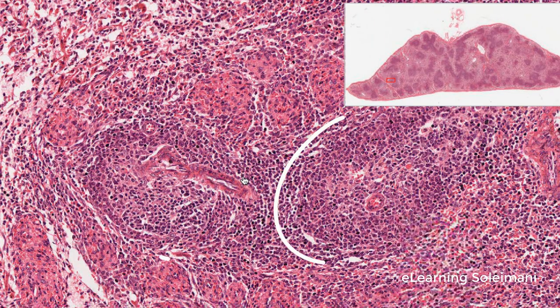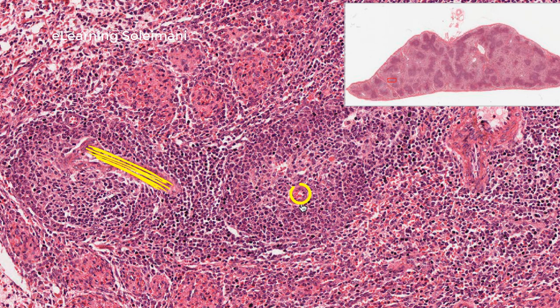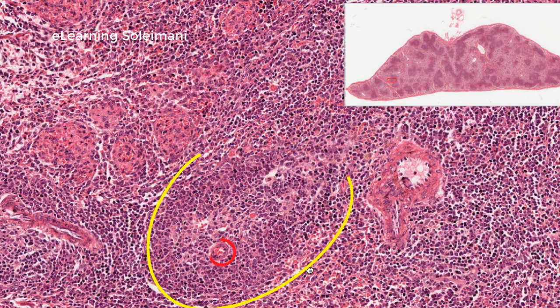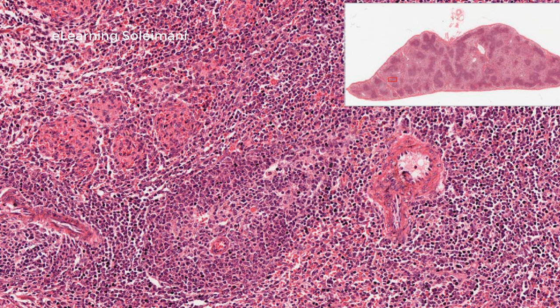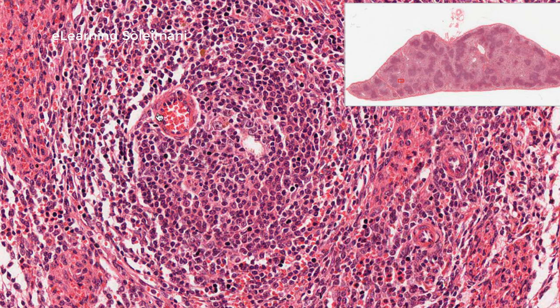Here we see the white pulp. Inside the white pulp, we can see the central arteriole. In spite of its name, the central arteriole isn't necessarily in the center. It might take a non-central position because of the change in the size of white pulps due to lymphocyte proliferation. The white pulp's size changes when exposed to antigen.